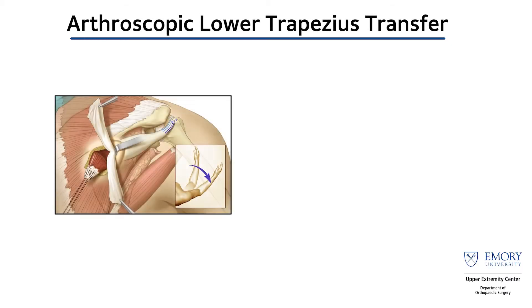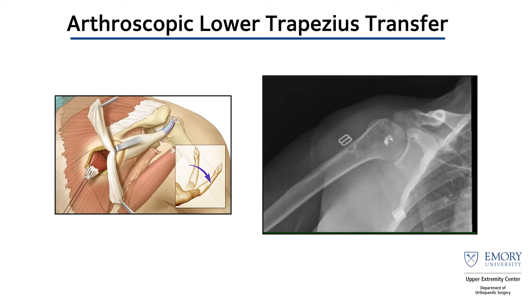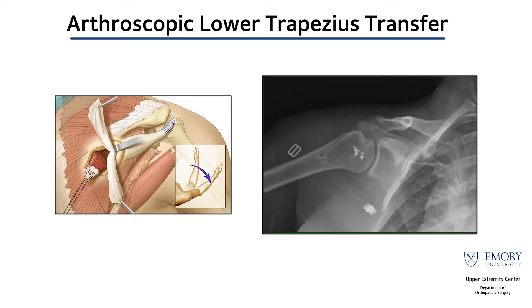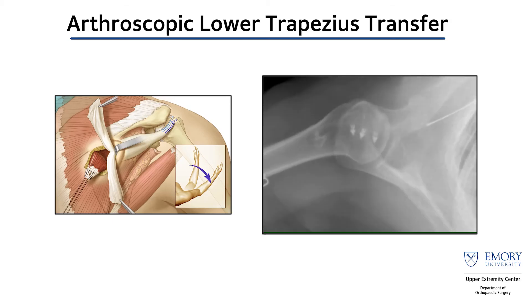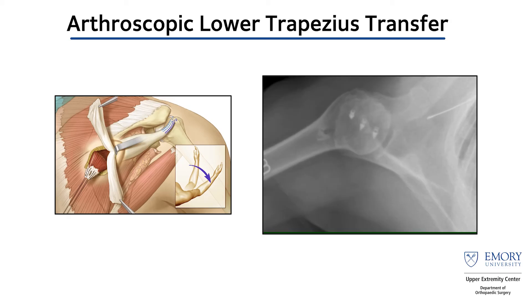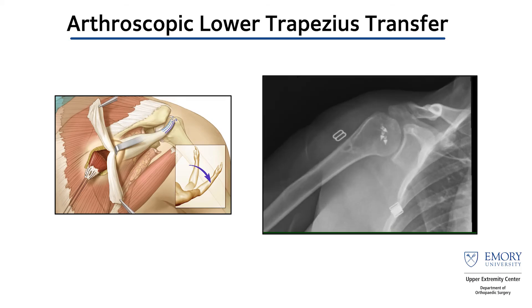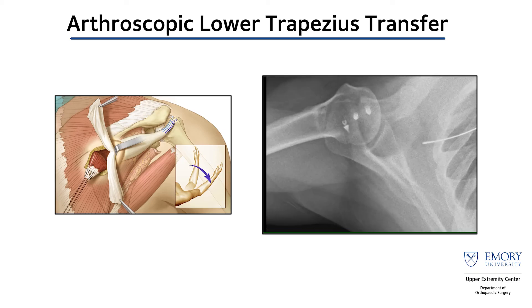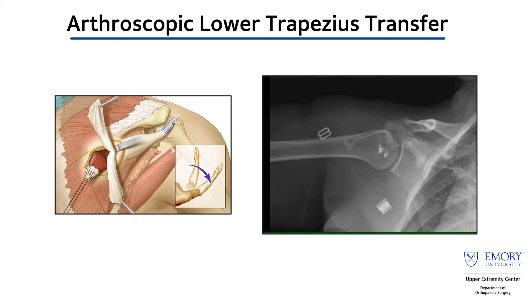You may also want to look at how your patient is doing after an arthroscopic lower trapezius transfer. With that massive cuff tear, you saw the superior subluxation. You can see that with this lower trapezius transfer, we were able to pull the head back down, and now it almost looks like a normal shoulder — both with regards to rotation and abduction. You can see we've recentered the humeral head on both the axillary plane and the Grashey view, and we've almost re-established a normal shoulder with this procedure.